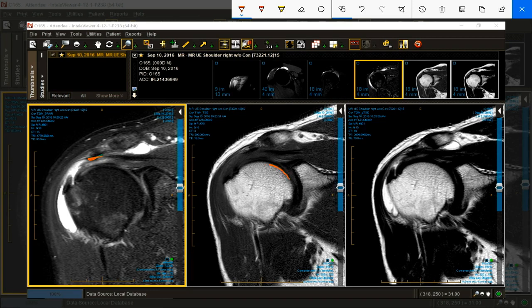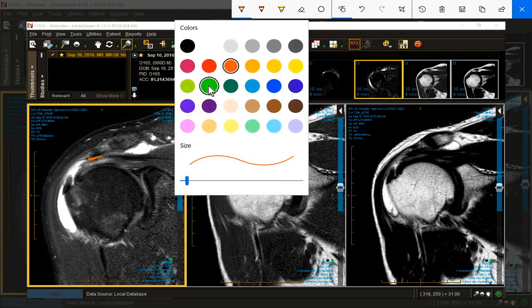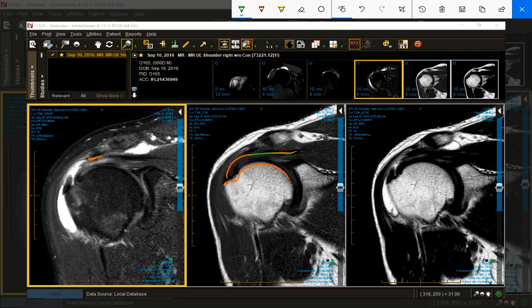We've got a humeral head. And the humeral head has a cuff coming on top of it. I think I'll draw the cuff in another color. And we can see parallel fibers in our rotator cuff, and it has a footprint of insertion right there.